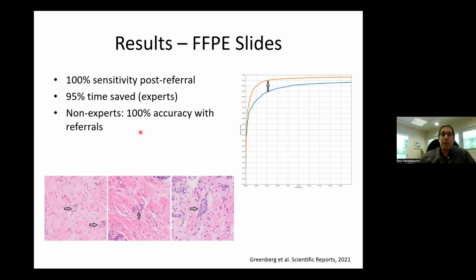So we had quite a few cases where the algorithm highlighted, just like the examples that we see here. These are not classical ganglion cells. Okay, so these are immature ganglion cells, and the algorithm highlighted these events, but the non-expert pathologists that view these small images mark them as non-ganglion cells.